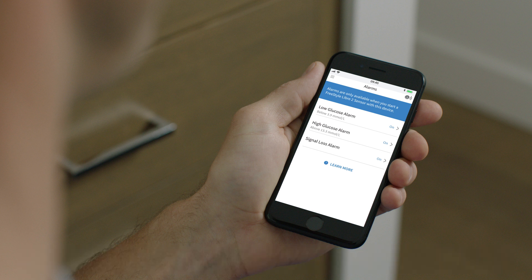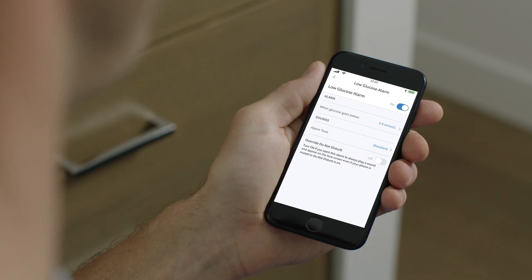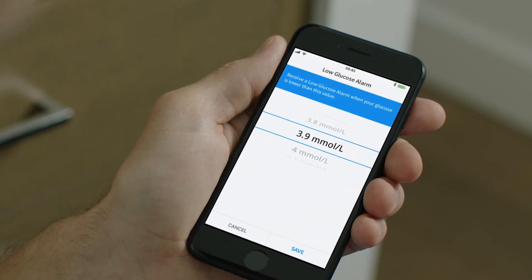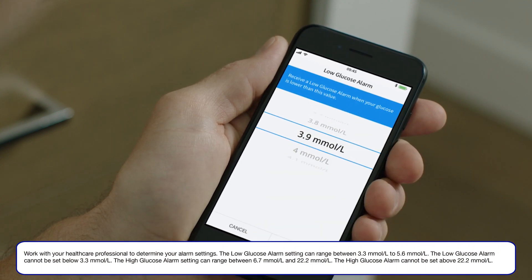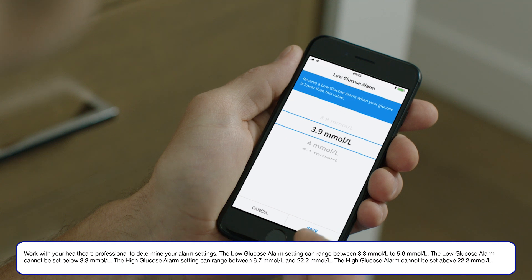On the alarm screen, touch Low Glucose Alarm, which takes you to the next screen. Next we'll set the low glucose alarm level. Touch the arrow to get to the next screen, then scroll up or down to select a low glucose value. My doctor and I have chosen 3.9 millimoles per liter. Once you've chosen your glucose level, save it.